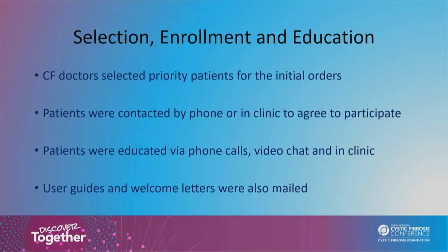And you also have to remember that we're a pediatric center, so we have a patient that's going to use the device and an adult that's going to take care of the app, putting the information in, and having the patient use that. So almost everything was done by phone initially to get them to agree to participate. And then sometimes we asked a patient in clinic if it was convenient, if they were coming into clinic.